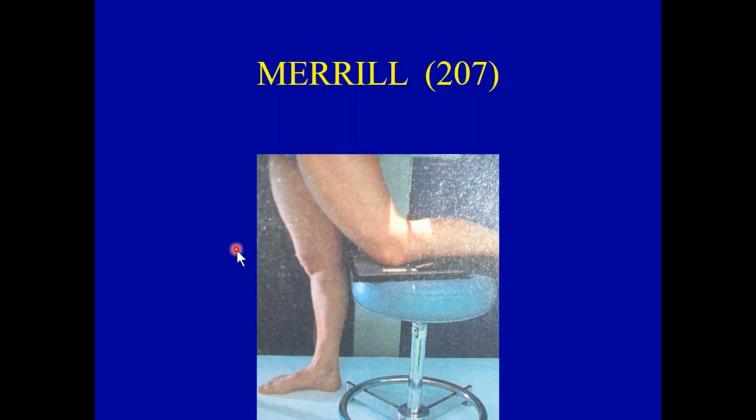I did a lot of x-ray taking using a chair, or if I was doing a knee, if they could get sitting on a rug in the x-ray taking room, that's what we did. So I did a lot of shoulders, wrists, and hands using this technique. As long as this distance to the front of the x-ray tube, not the collimator, is 40 inches. So someone has to get a measurement device and measure that. It's not the front of the collimator, it's actually the middle of the x-ray tube.